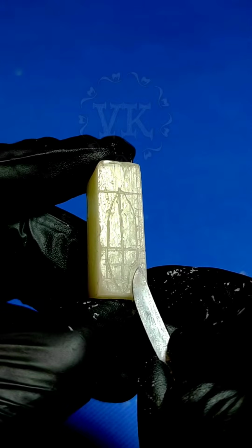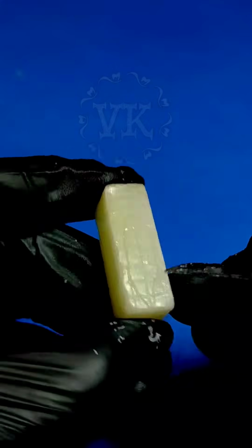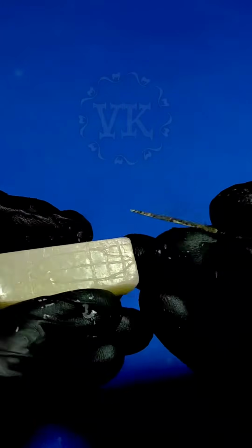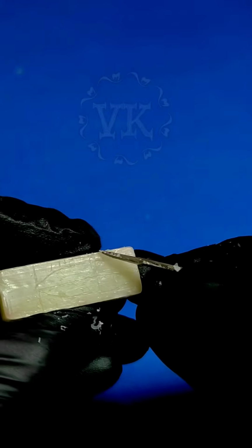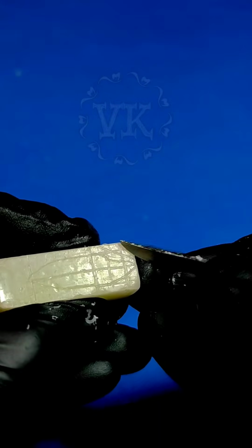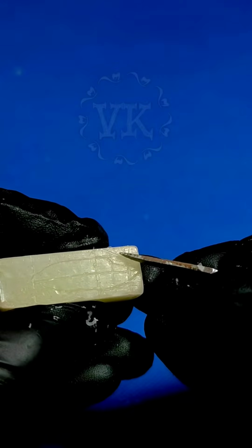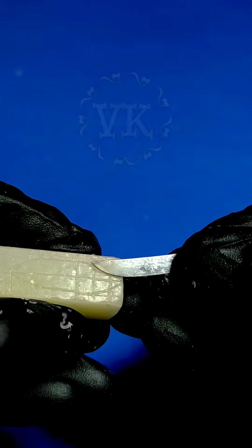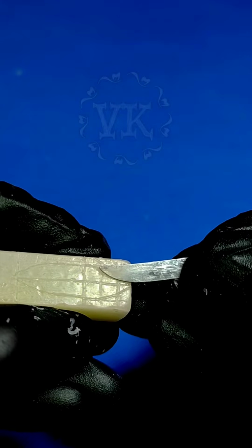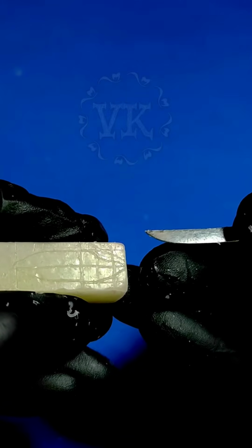So the concavity, we will start as a flat surface initially. For example, I'm going to create a flat surface which goes from here to here. I'm going to remove all the wax here, and then after I come close to this line, I start using the back side of the carver. So this matches with the concave surface, and it automatically gives me a curved surface for the lingual area.